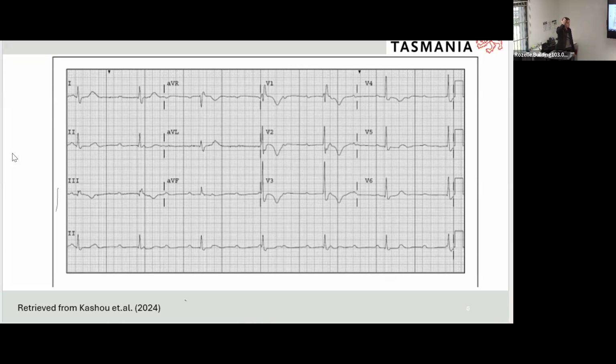All right, so in our groups, we're going to try and do an ECG interpretation each. There are 10 on the worksheet, so we'll break you up into maybe groups of 2, I think, maybe 3. How many people have we got? 31, so 3 people per group. If you're group 1, can you do ECG 2, and so on and so forth.